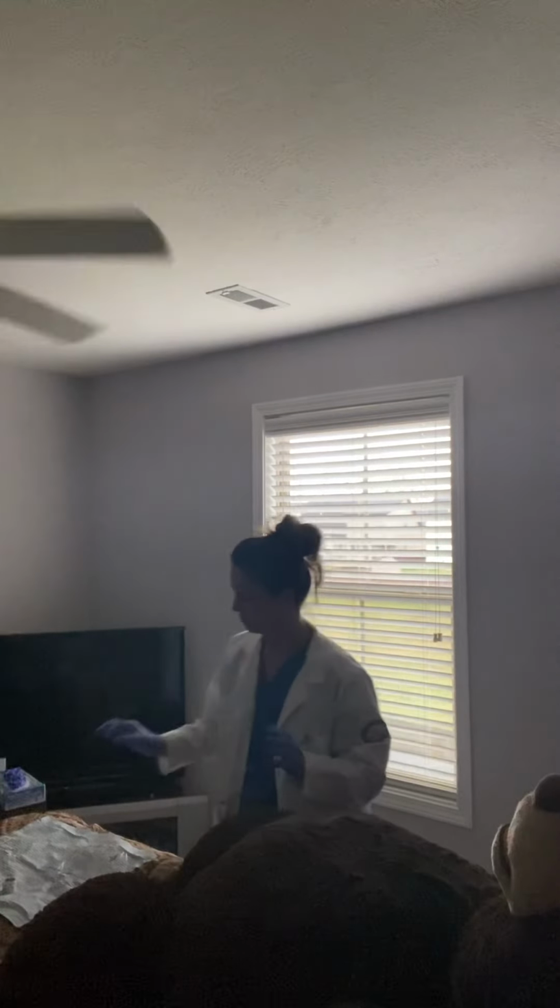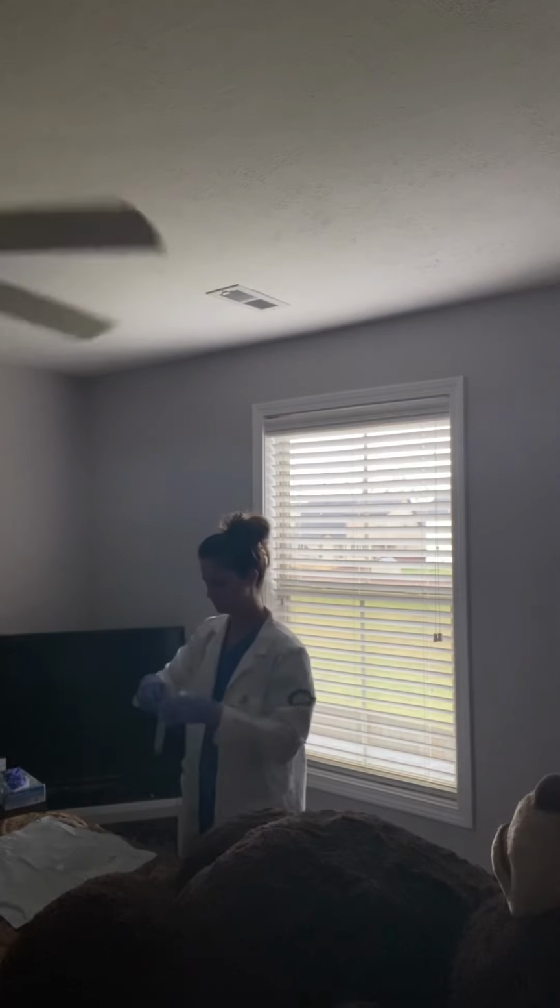Then I want to prepare my tape for my dressing. Since there's not a whole lot of drainage, I'm going to just do a couple pieces of tape.